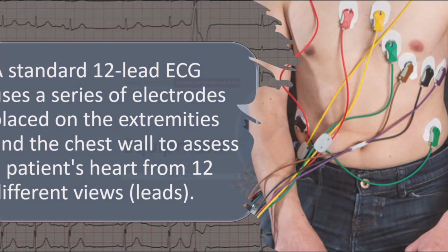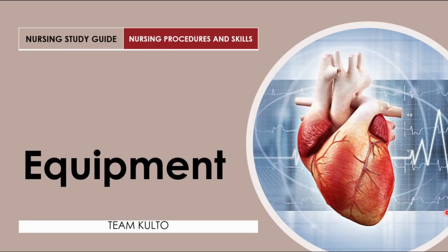Alright. So, ano-ano ba yung mga equipments na gagamitin mo when you are going to conduct ECG? Remember that for you to maximize your time and conserve your energy, you need to gather all the equipments prior to going to the patient's bedside, kung ikaw nasa ward or kung ikaw ay nasa ER, para naman isang bagsakan na isang puntahan lang. Okay? So, ito na yung mga gagamitin mo, girl.